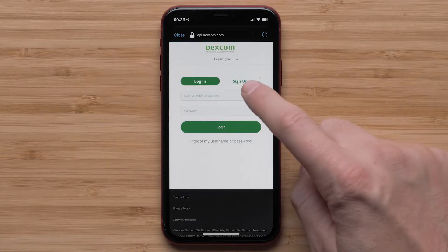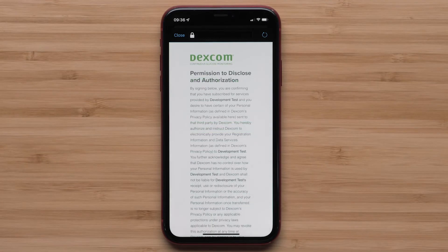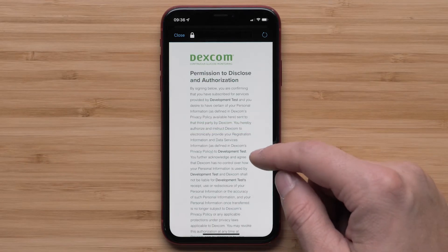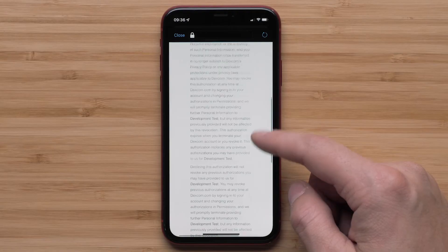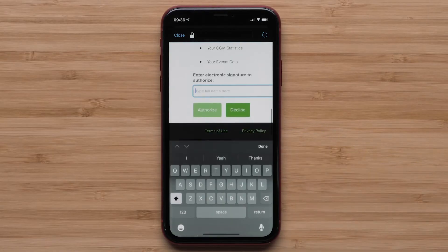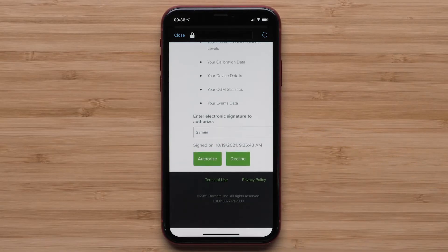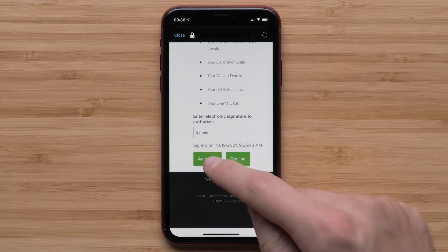Enter your Dexcom username and password to sign in. Accept the usage terms and enter your name to eSign, then tap Authorize at the bottom.